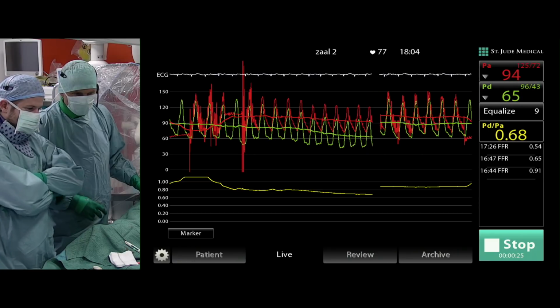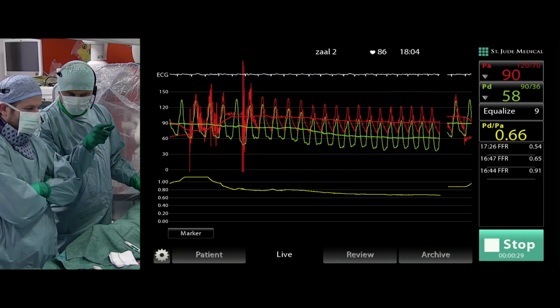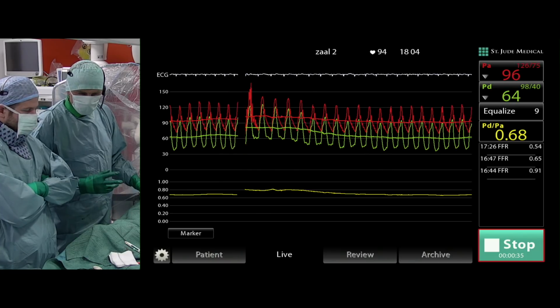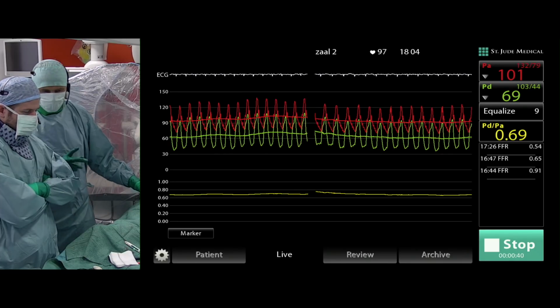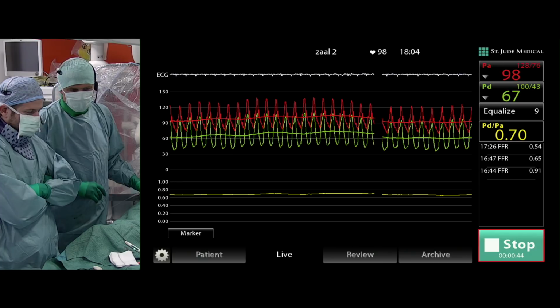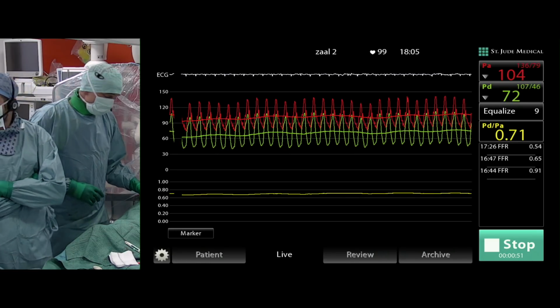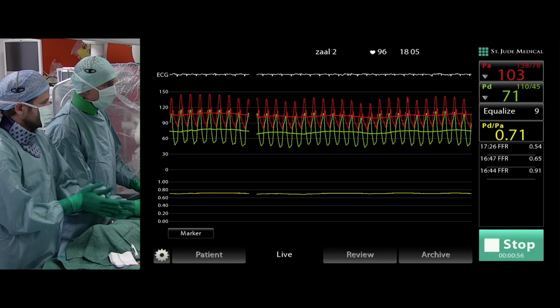We flush with saline, as I mentioned. Sorry for all these artifacts. Yeah, it's clearly positive. Quite depressing. By the way, also very reassuring, the red signal remains normal, which means that probably the left main ostium is normal. You are going to say, yeah, but the guiding is maintained outside the left main. Yes, but probably it's still a little bit in left main. So it's slightly positive, so we have to go.